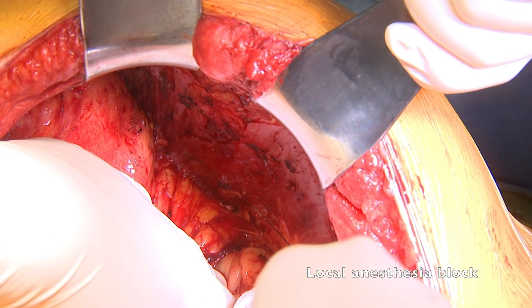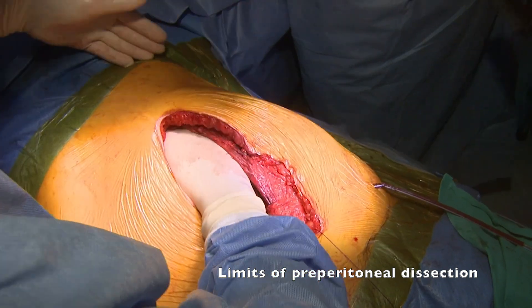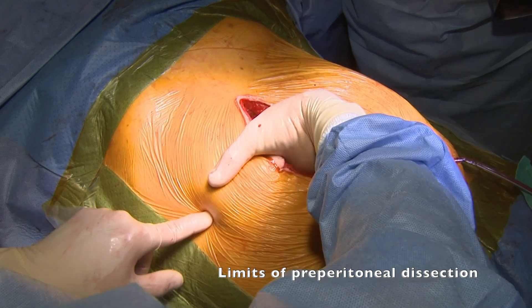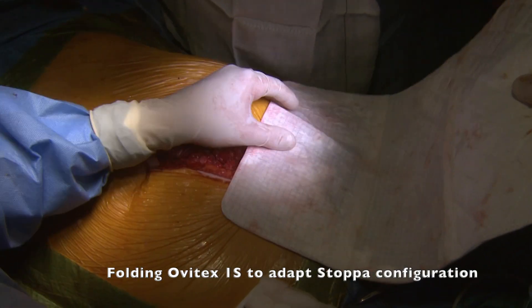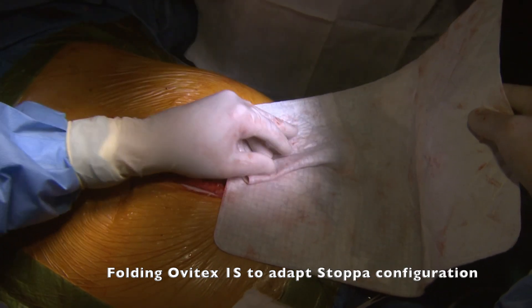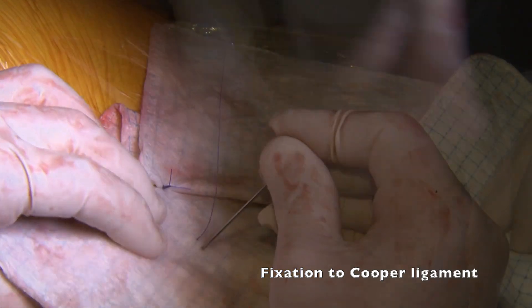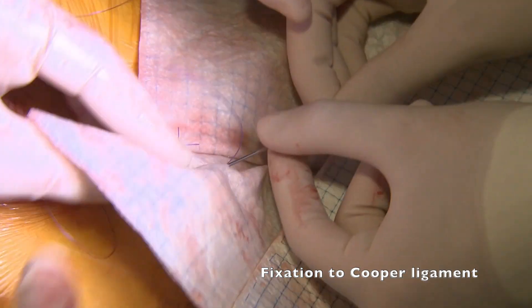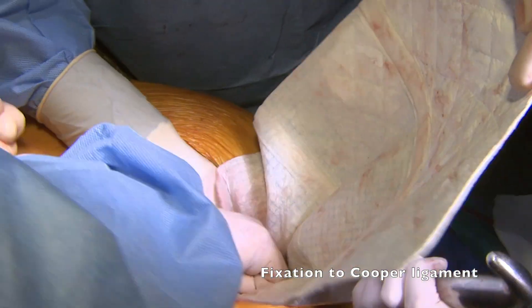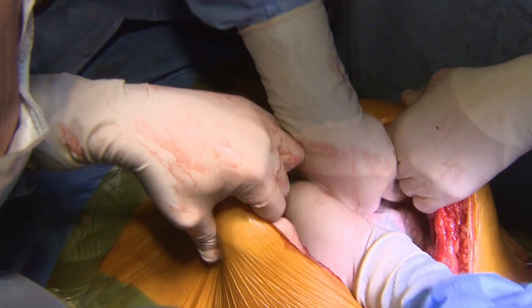Local anesthesia block is now infiltrated between the transversus abdominis and internal oblique muscle. Here we show the limits of the overextended dissection obtained between the abdominal wall and the visceral sac. For this case, we chose a tissue ovine collagen matrix reinforced with polypropylene. As we wanted to get enough retroperitoneal overlap at the iliac and inguinal area, we decided to shape the 40x25 cm mesh with a small folding to obtain a three-dimensional configuration. A stitch helped with this task. The only point of fixation is to the ipsilateral Cooper's ligament. We then extended the mesh over the peritoneal sac making the Mexican taco or Stoppa configuration.